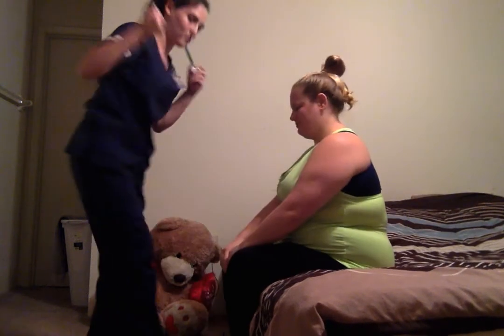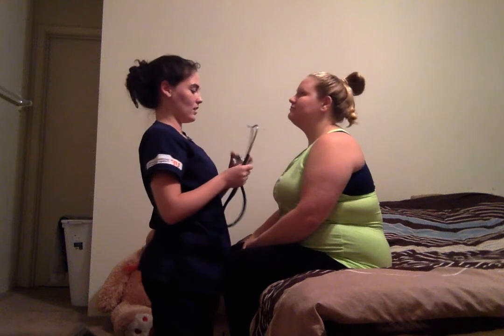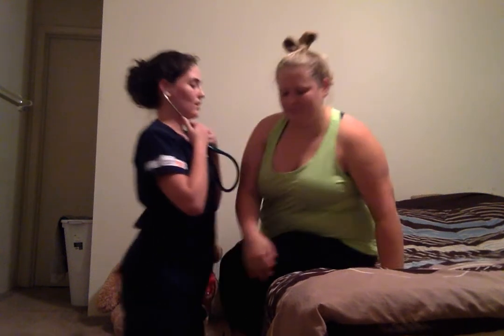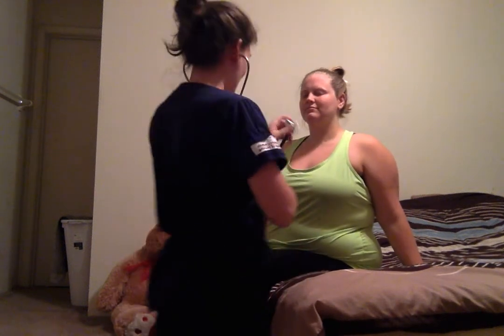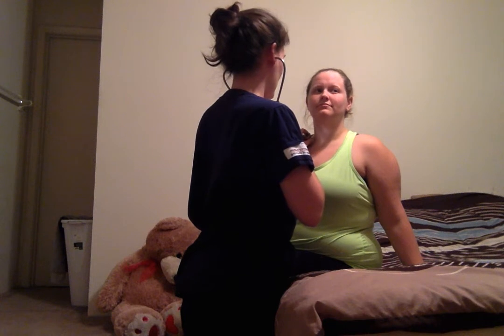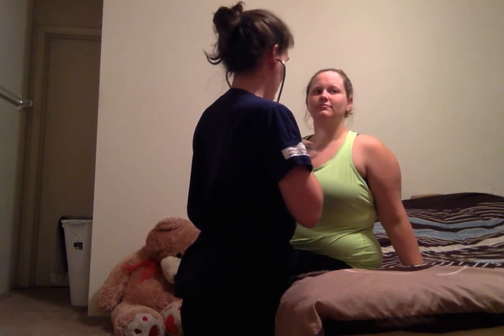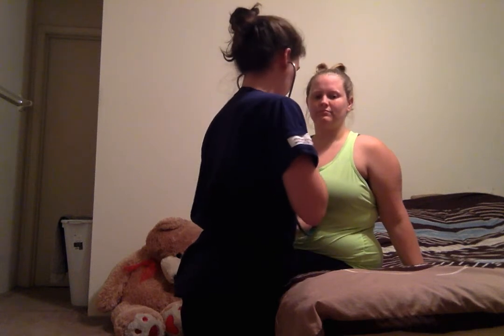Now I'm going to auscultate. I'm going to do lung sounds first. And I'm going to do all lung sound areas. So I'm going to start way up here, and I'm just listening for adventitious sounds and vesicular, bronchial, and bronchovesicular.